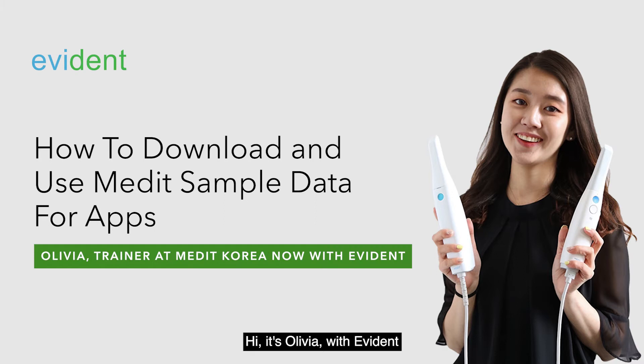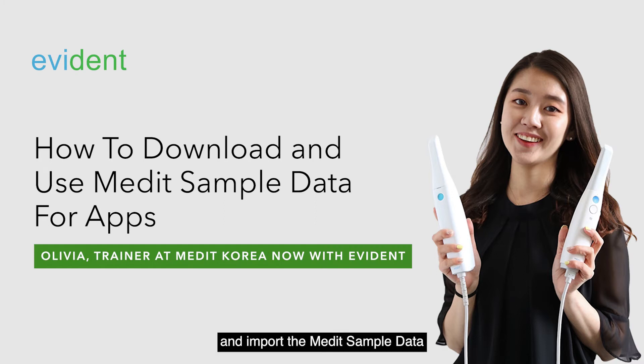Hi, it's Olivia with Evident. In this video, we'll be learning how to download and import the Medit sample data with the case converting tool.